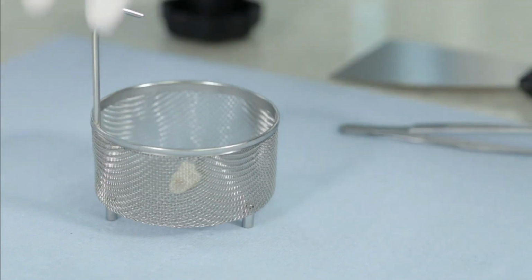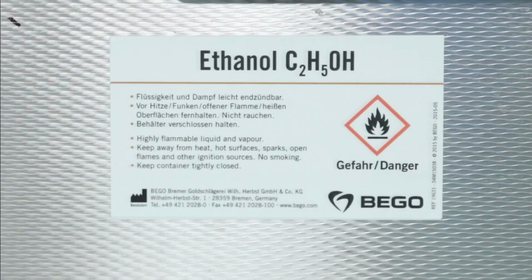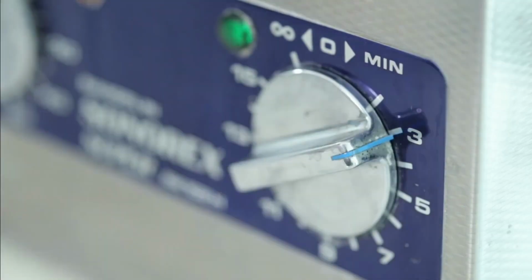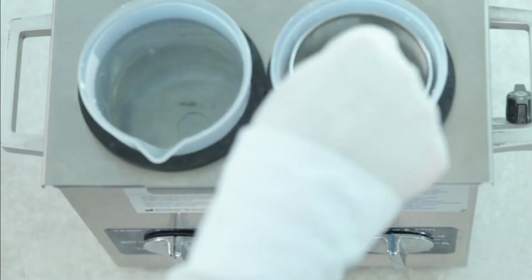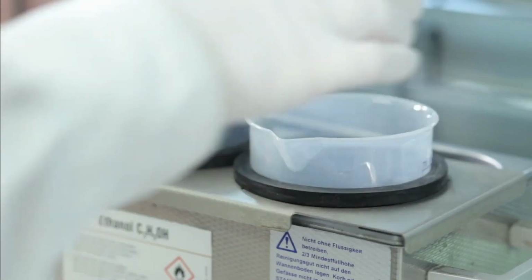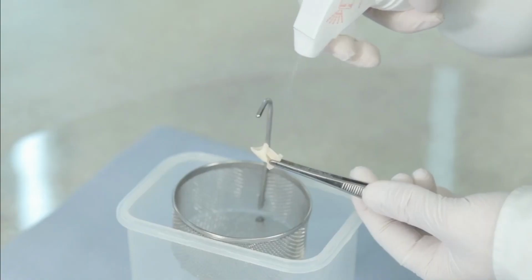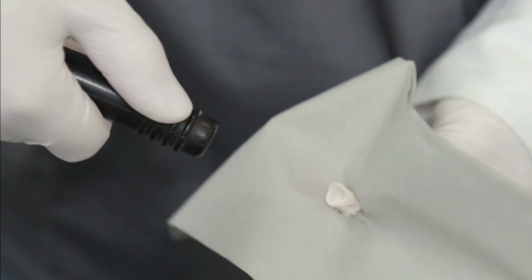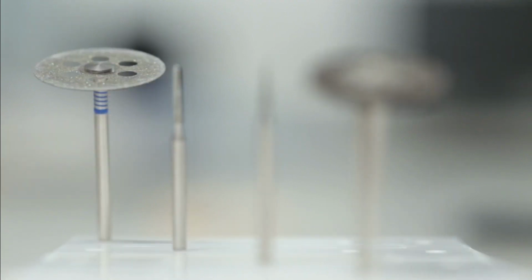The object is placed into a wash basket and put into the first bath. Here they use ethanol. You'll want to make sure it's set for 3 minutes, and that's unheated. Next, it transfers to a clean bath of ethanol for 2 minutes, again unheated. It's then rinsed using some fresh ethanol, blown dry and inspected, and you should see that chalkiness, uniform chalkiness on the outside.